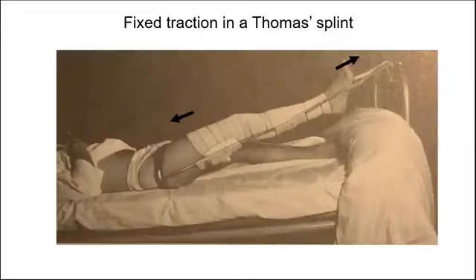This one is a fixed traction using a splint, but at the same time allowing you to do elevation either over the lower section of the bed, or a Braun splint. Again, this could be temporary while you await definitive fixation.